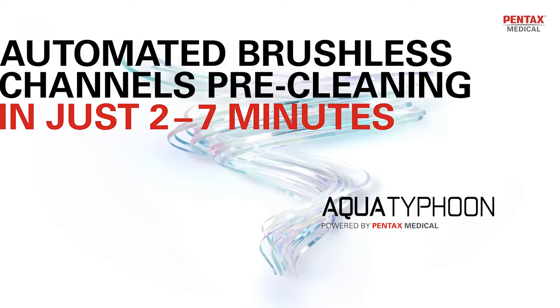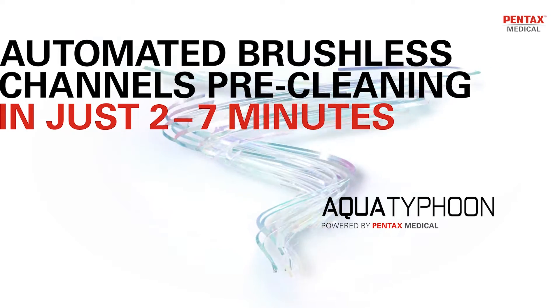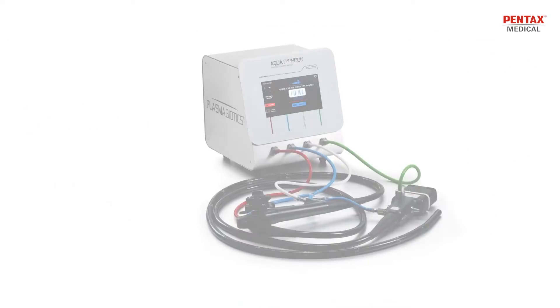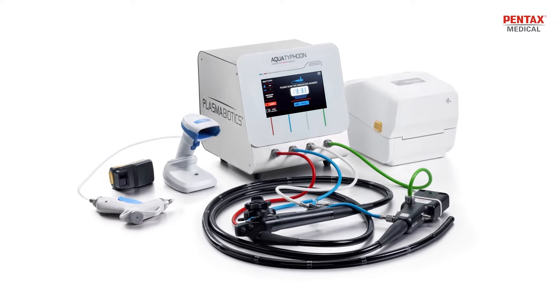In line with its hygiene commitment, Pentax Medical, in collaboration with Plasma Biotics, is delivering a breakthrough innovation in cleaning capabilities for infection prevention and control. The Aqua Typhoon is an automated device for brushless pre-cleaning of endoscopes — an alternative solution to manual pre-cleaning.